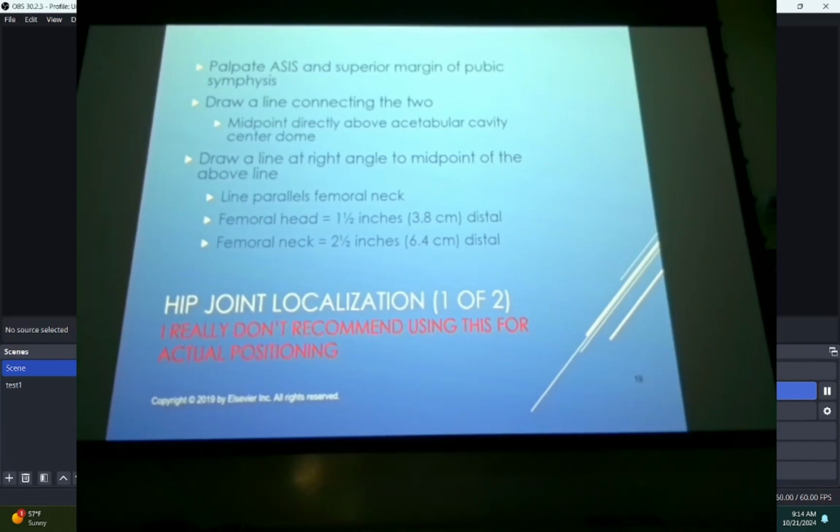You find it. Okay, so if you look on page 389 and you read through all those localization anatomic structures and all that. So the diagram, especially figure 8-8.12, is telling you how to find the different structures in the hip and the proximal portion of the femur. Okay, so what it says to do is to imagine a line that goes from the symphysis pubis up to the ASIS. So the only way you're going to find the symphysis pubis is by palpating.